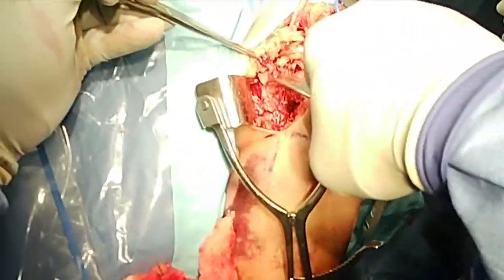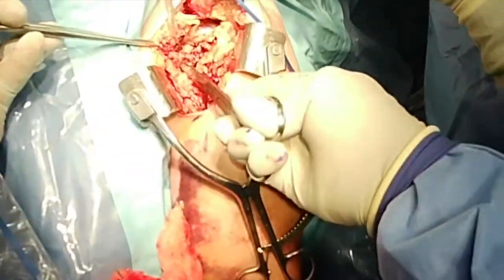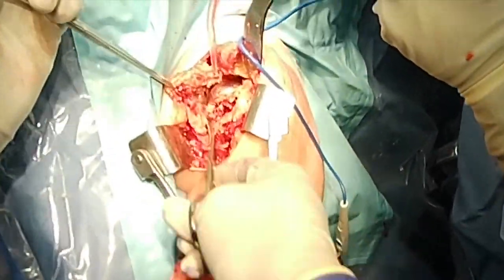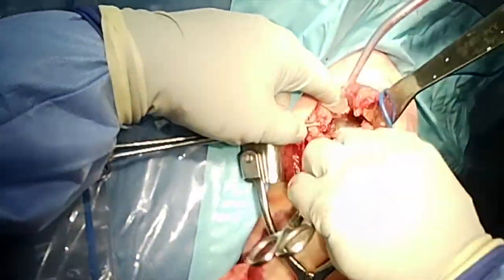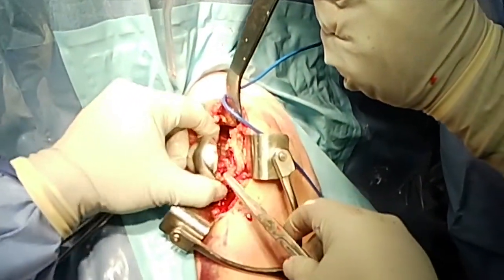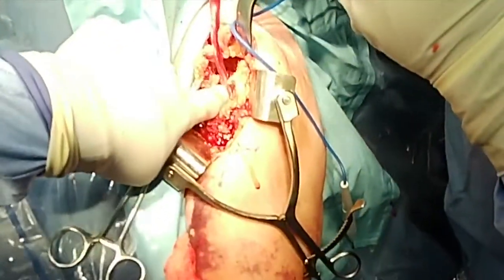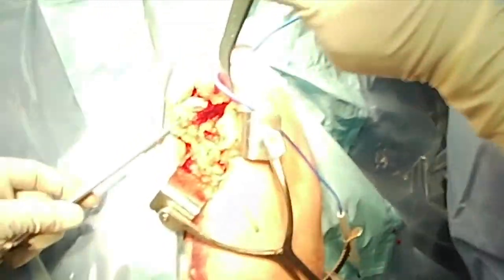Once you lift this up, I release from the front of the glenoid as well as from the pectoralis, which allows a decent excursion on the subscapularis bone-tendon interface. After this, the prosthesis can be easily removed, as you can see here. You can see the fracture was quite high and going into the head, which would have precluded any attempt at fixation in this scenario.